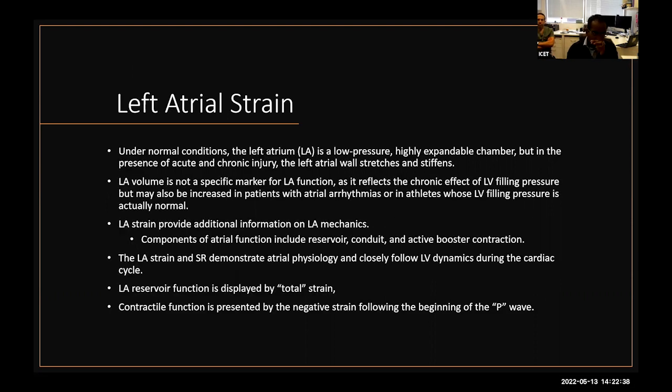LA strain gets a bit more tricky because it has been more recently acquired, and it has gained more attention, and it can measure the different functions of the left atrium. Under normal conditions, the left atrium is a low pressure, highly expandable chamber, and you can commonly see LA dilatation when there's any evidence of elevated left ventricular pressures.